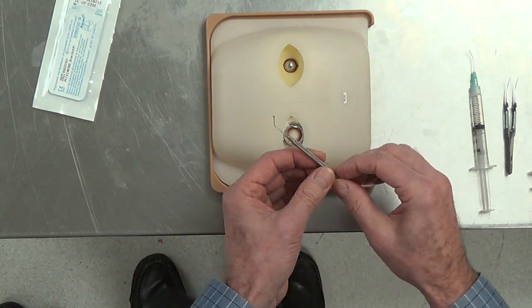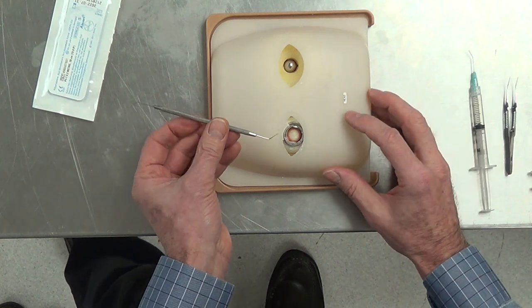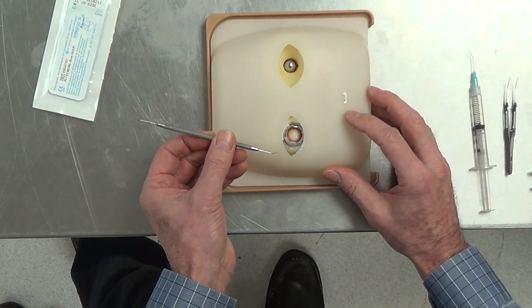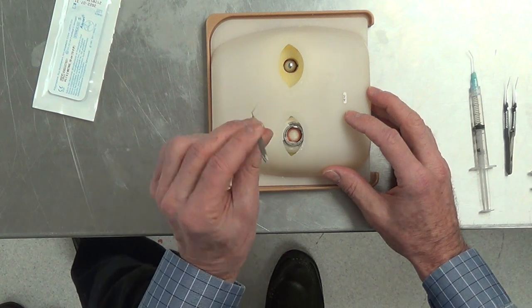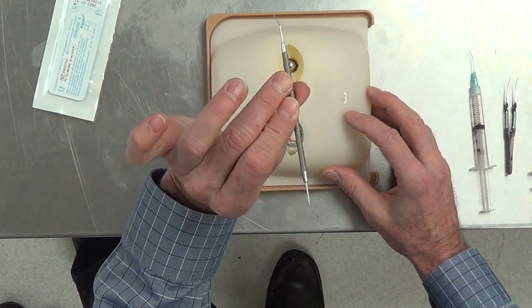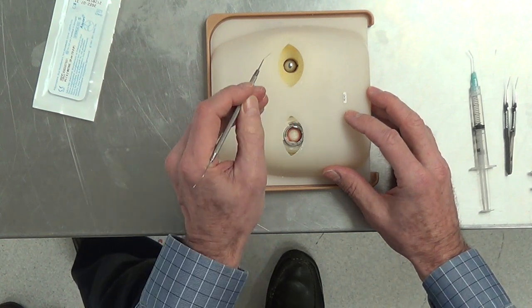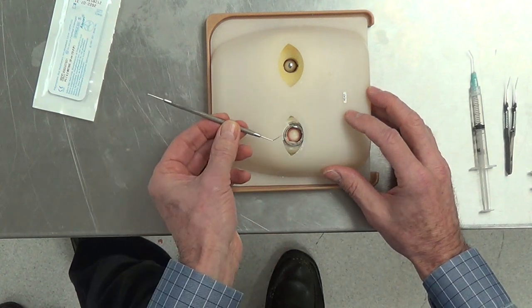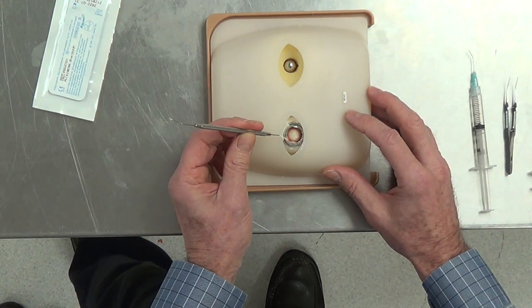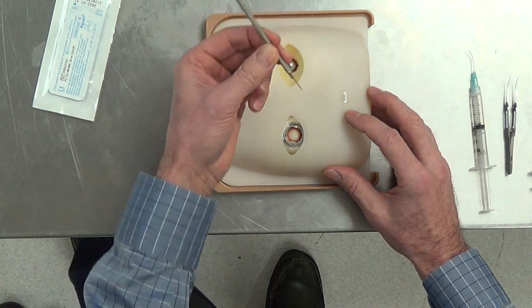The first instrument we're going to talk about is an angle instrument — we'll call it a chopper. When we manipulate with the chopper, we need to hold the instrument as a dart, not as a pencil. Pencils are held like this; darts are held like this. In order to manipulate and have the most flexibility and control, we need to hold the instrument like a dart.